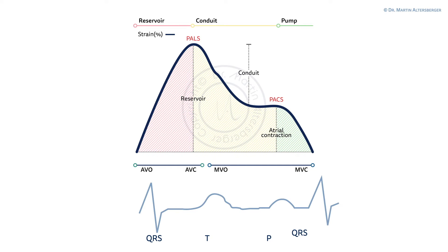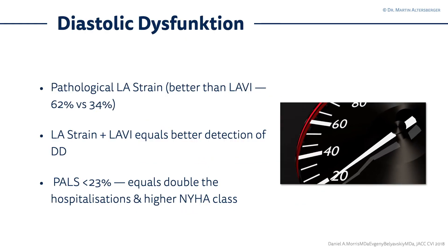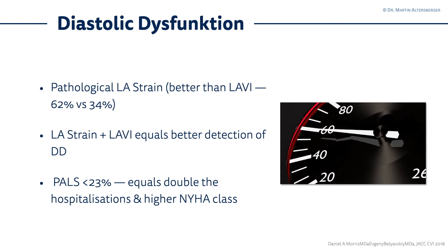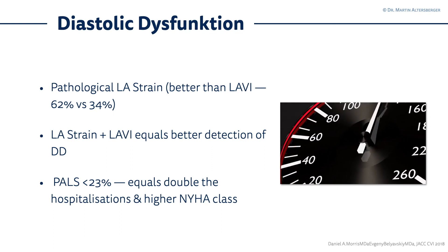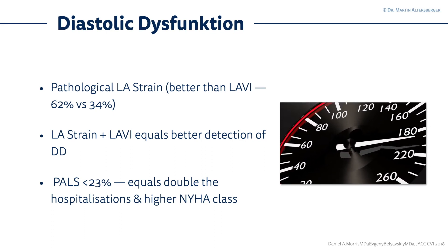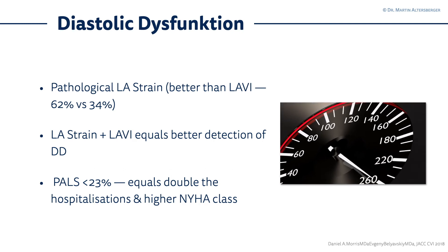This is how it looks: first the filling of the left atrium, then the filling of the left ventricle in diastole. Why would you measure LA strain in diastolic dysfunction? The LA strain, when pathological, is better than the left atrial volumetric index for identifying whether diastolic dysfunction is truly present. If you combine LA strain measurements with the LA volumetric index, you will have better detection of diastolic dysfunction.